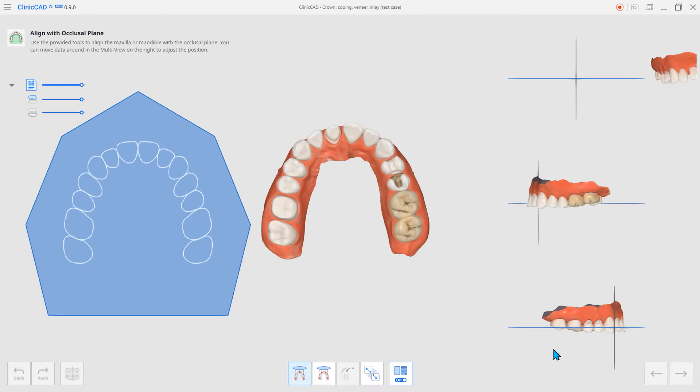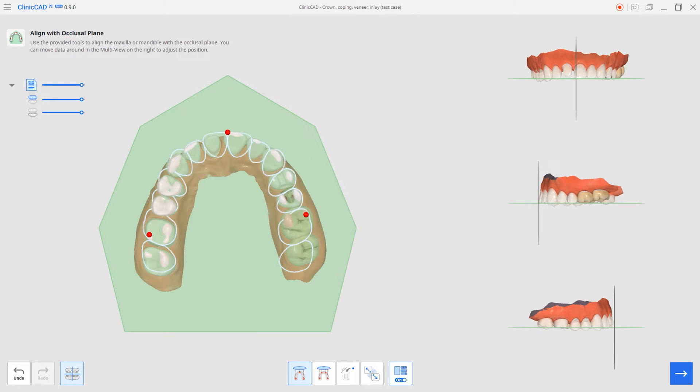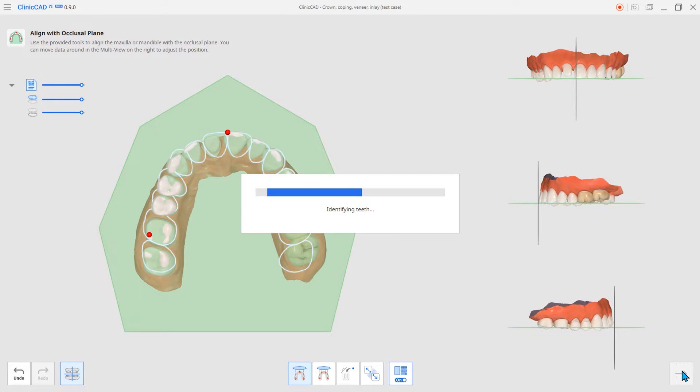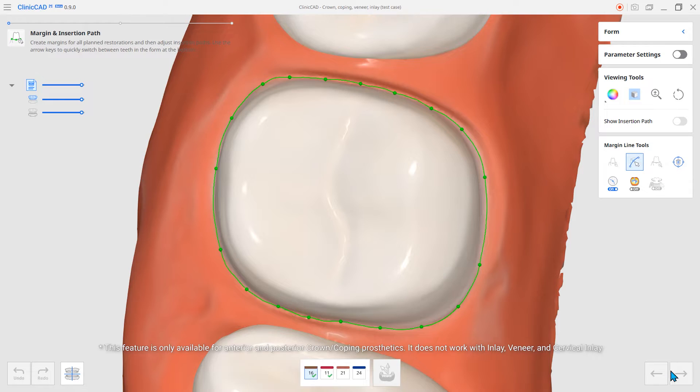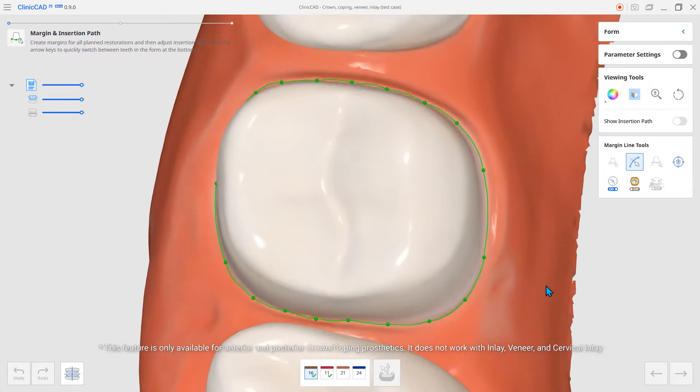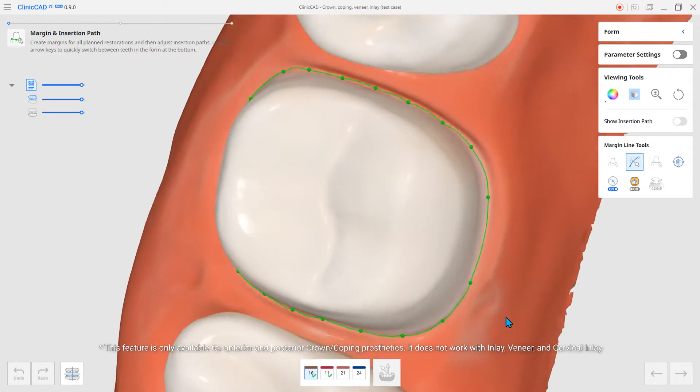First, let's look at the AI Automatic Margin Line function. The AI in the system automatically sets the margins of the teeth.